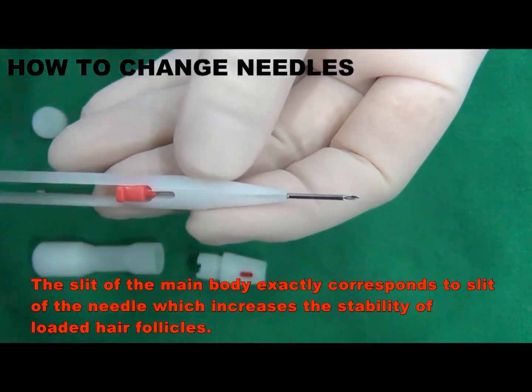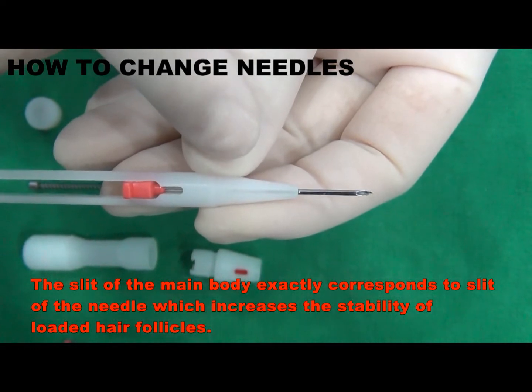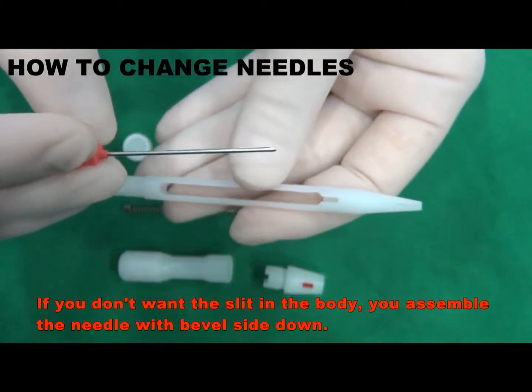The slit of the main body exactly corresponds to the slit of the needle, which increases the stability of loaded hair follicles. If you don't want the slit in the body, you assemble the needle with bevel side down.